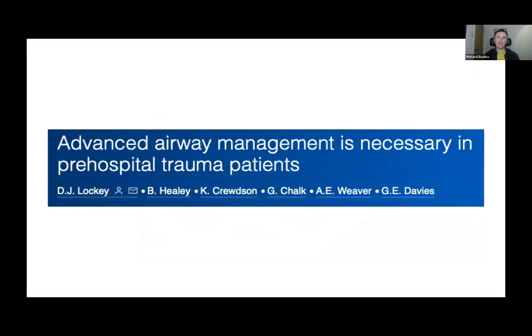Now, hopefully that's reduced for a lot of reasons, but there's an argument that that's less likely to occur with a videolaryngoscope, where you virtually always have a good view of the glottis, including as you pass the tube into the glottis itself.